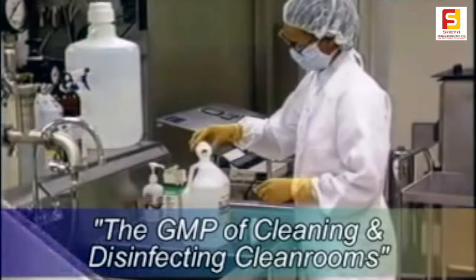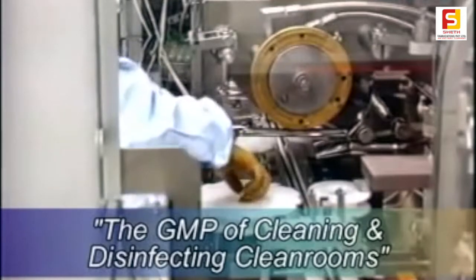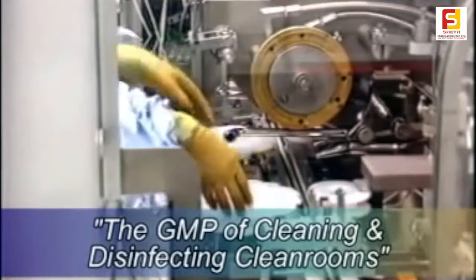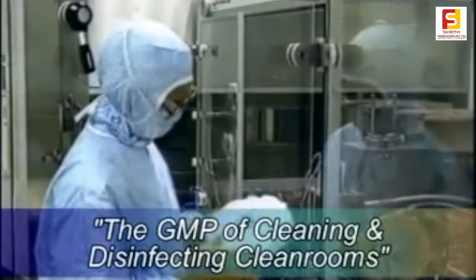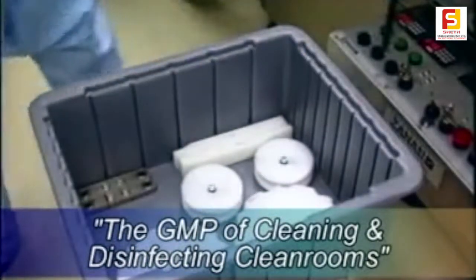Water should never be added to the cleaning agent. Removal from machinery and equipment of all component parts which require separate cleaning is required. Care should be taken when breaking down equipment so that components are not scratched, chipped or damaged during the disassembly process. These parts should be removed from the room and placed in the reprocessing area.